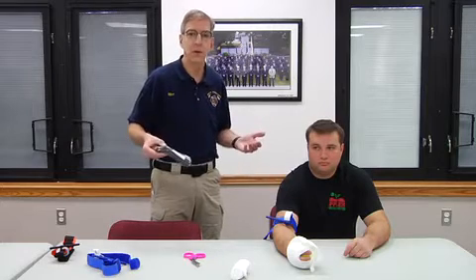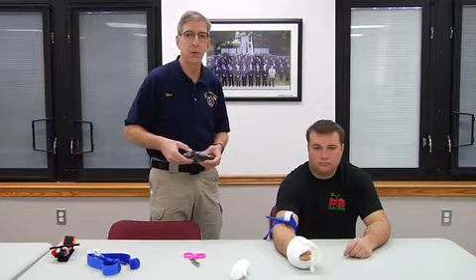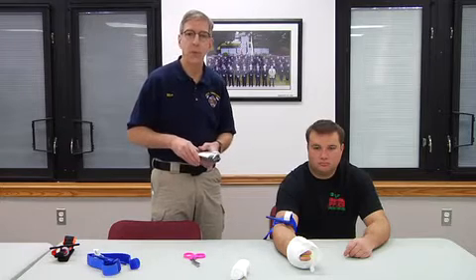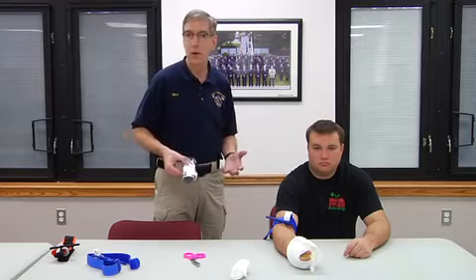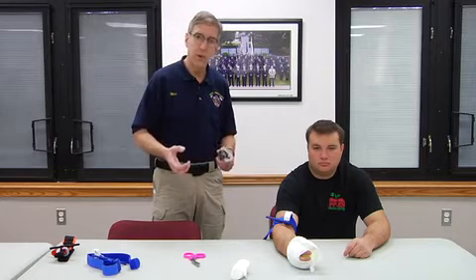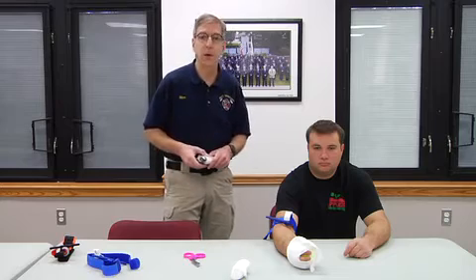The faster a tourniquet is applied, the more effective it is. An initial application of a tourniquet has to happen very, very quickly. So look at your tourniquets and make sure that they're unwrapped from their packages and stored so that they're ready to use quickly. If you carry a tourniquet on yourself, make sure it is unwrapped from its packaging, put in a fashion so that you could quickly apply it to yourself or to somebody else if you needed to do it.